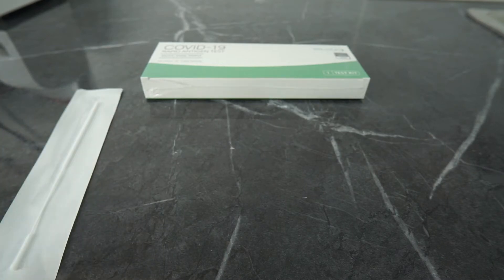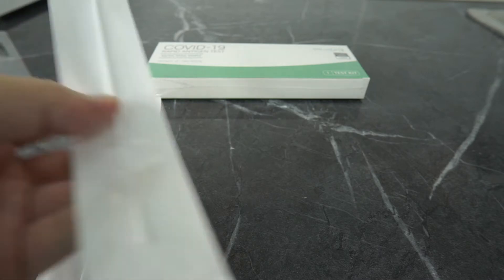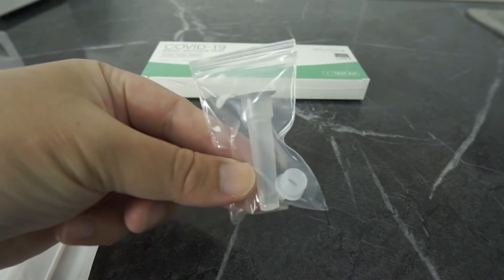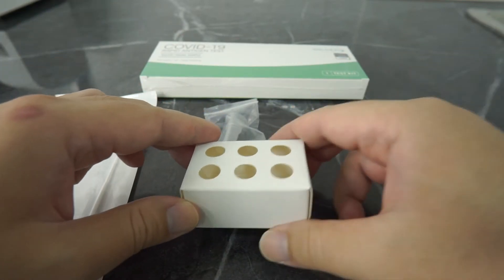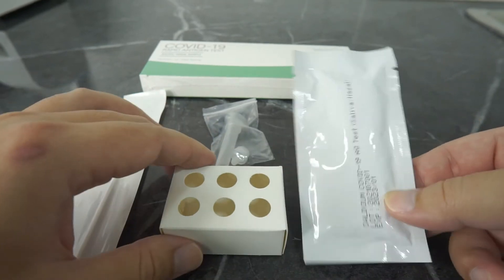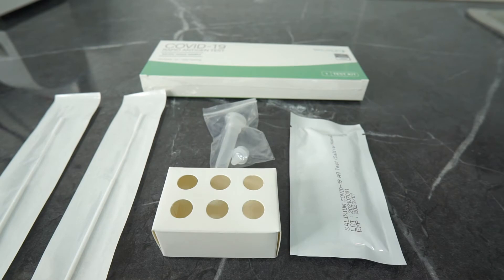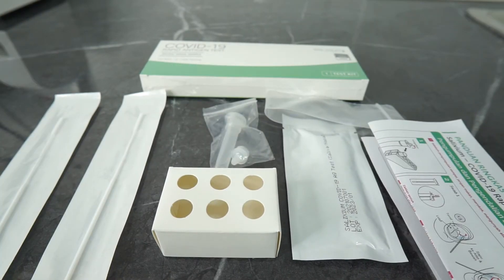Let's check the kit components. First, we have disposable swabs in individual sterile packaging — we have two of them. Number two, we have a self-extraction buffer tube and dripper. Number three, we have a paper rack. We also have a test device sealed in a foil pouch, and last but not least, we have the paperwork which is the instruction for use.